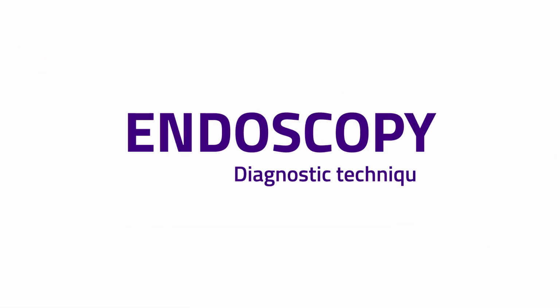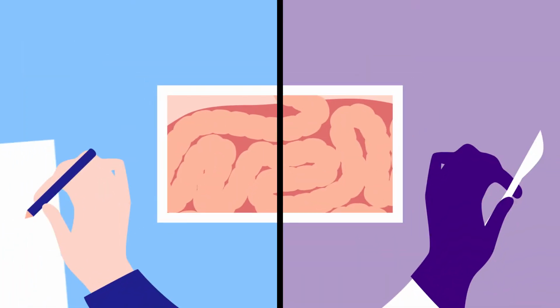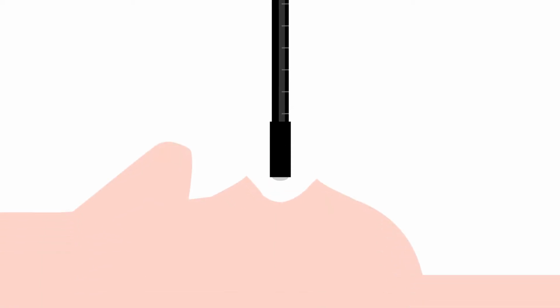Endoscopy is a diagnostic technique that gives us images of the inside of the human body and helps us perform surgery and detect diseases. Traditionally, the technique has used an endoscope, a long thin tube with a camera that is inserted into the patient's body.